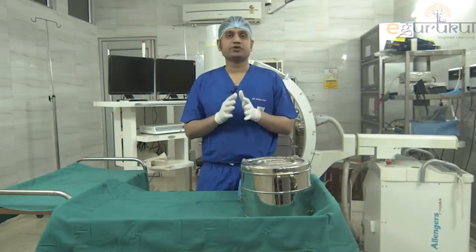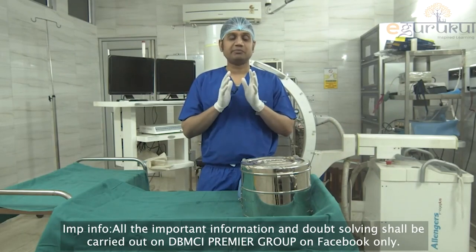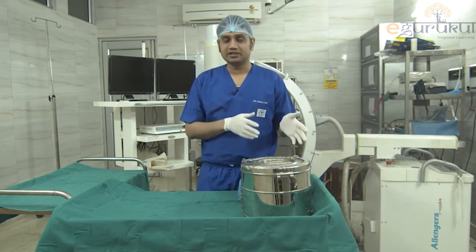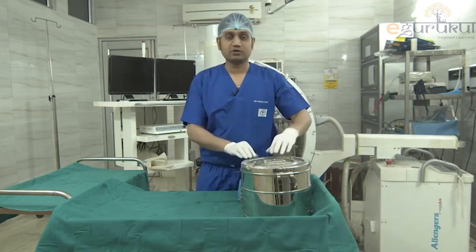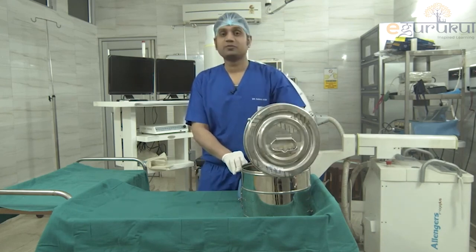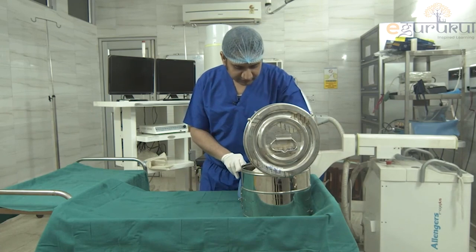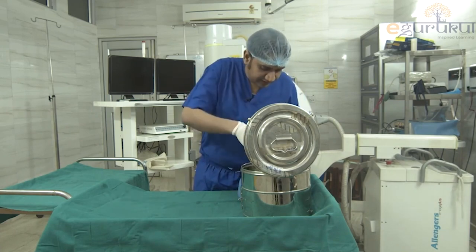The plan is to show the orthopedic instrument set. Let's go for unpacking — so many videos about unboxing Apple iPhones and so on, and here it is: the orthopedic drum set. Let's open it and see what we have.